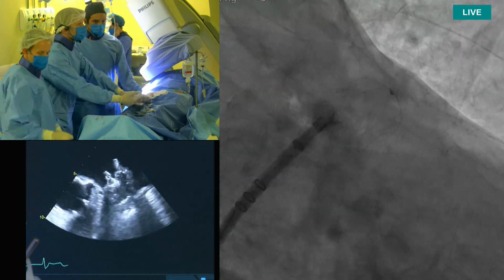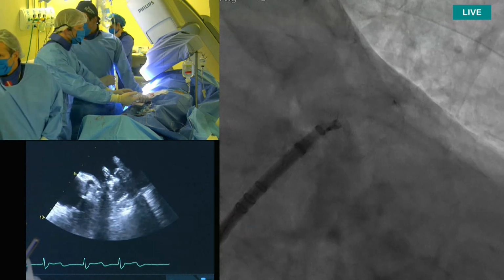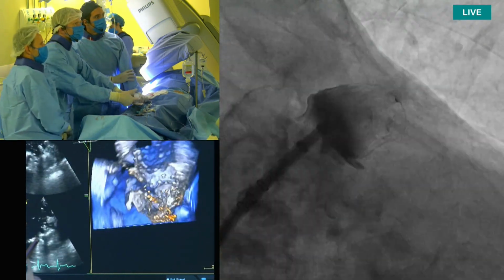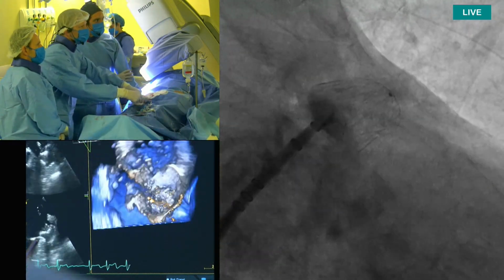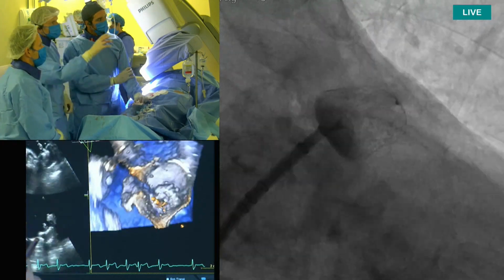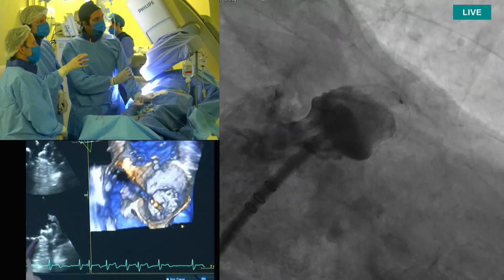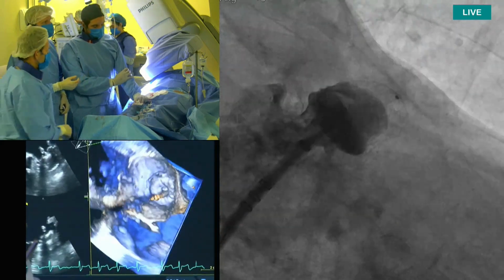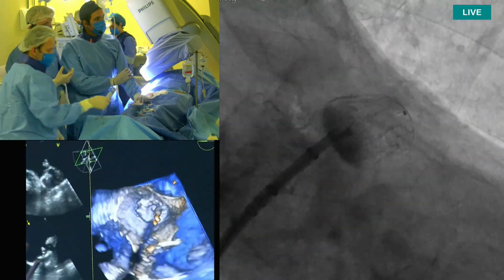All right. So let's do a cine. Yeah, let's do a cine. Felipe? Okay, so you guys, yeah, that's nice. It looks very good. Yeah, I like the position. So, and it's almost immediately occlusive. Also, of course, it goes still a little bit of contrast through the device, but the fact that there's a very slow washout, that's indicative that it's occlusive.